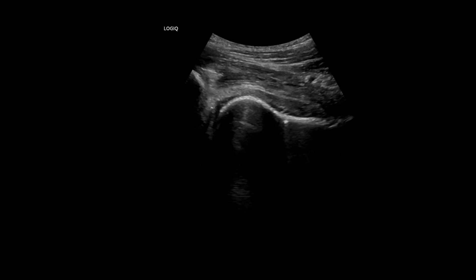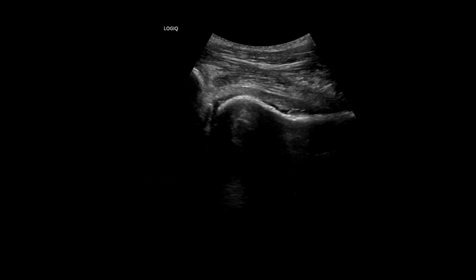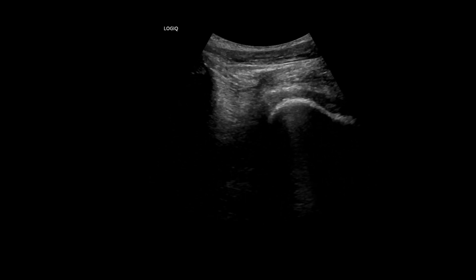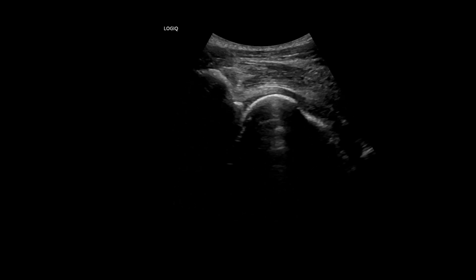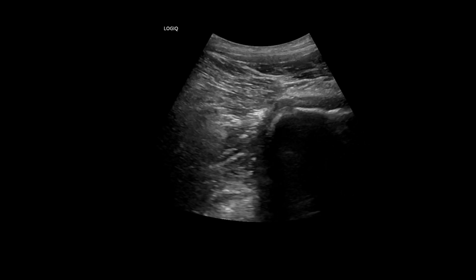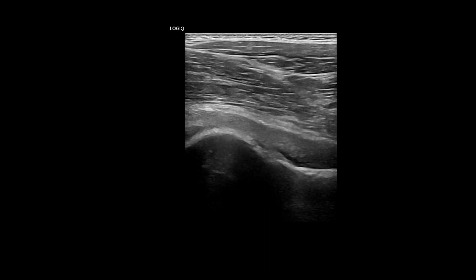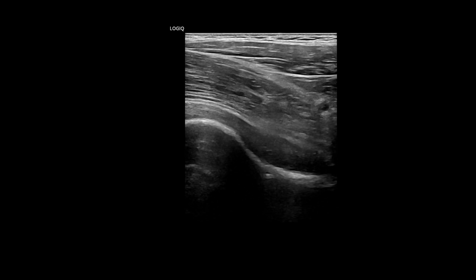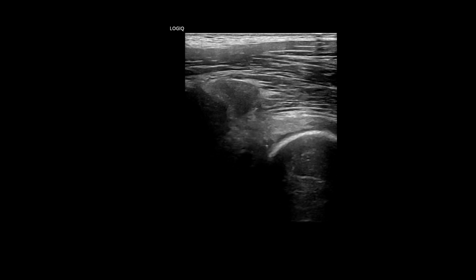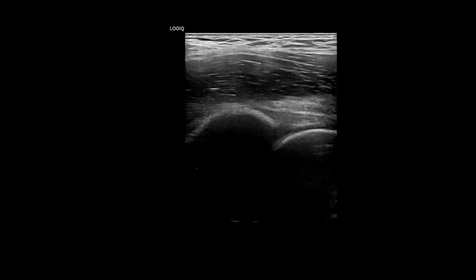Using a convex probe, I performed a longitudinal scan along the axis of the femoral neck and visualized the femoral head, femoral neck, and synovial recess. I identified joint effusion in the anterior recess of the hip joint. Switching to a linear probe, I could visualize the joint effusion more clearly and noted cortical irregularity along the anterior aspect of the femoral neck. There is a synovial outpouching in the upper lateral aspect of the hip joint.